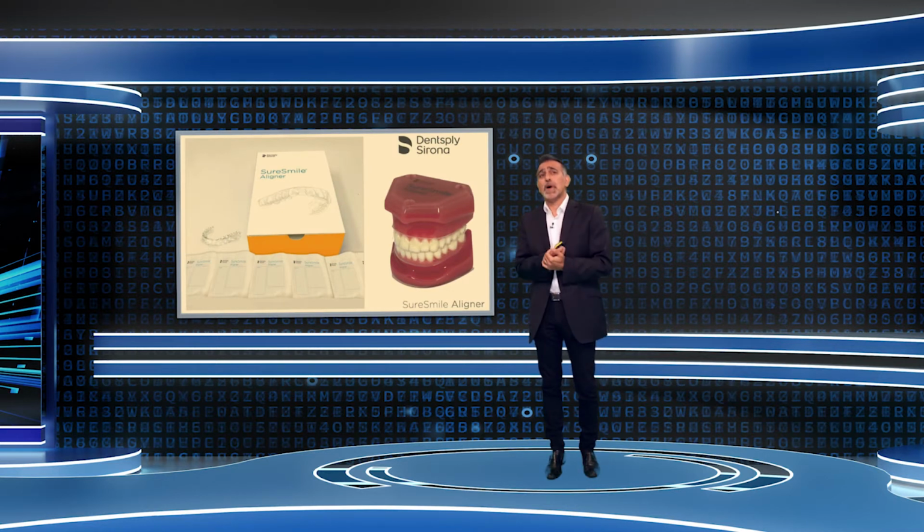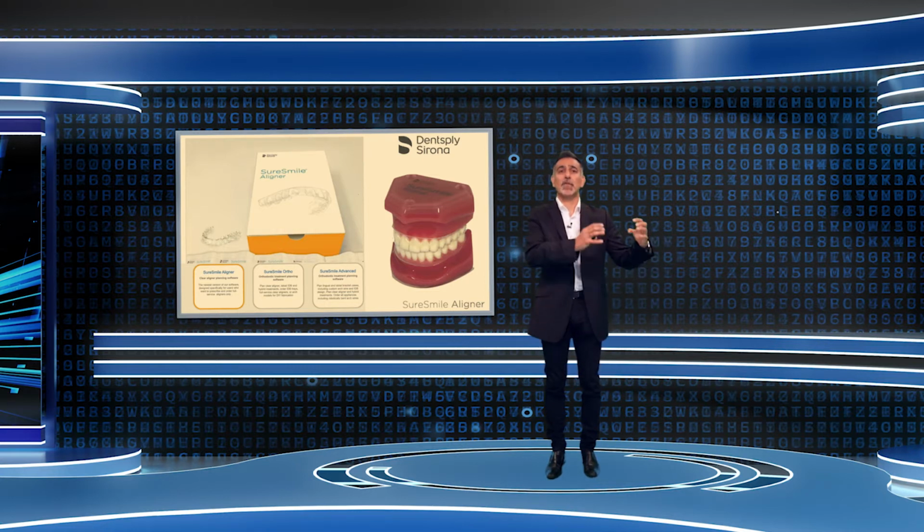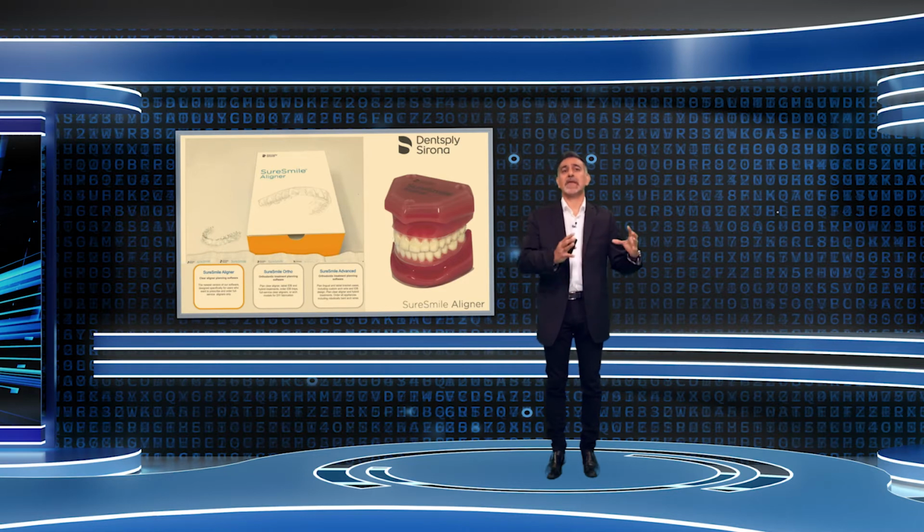So this is where SureSmile comes in, and I've been using SureSmile now for some time, done many cases. There's three main sections with SureSmile. You have SureSmile Aligner, that's what I use, which is fundamentally a clear aligner system where you will send your scans off with some instructions, and it's a full workup done by technicians who you'll discuss with. You'll see your digital setup, you'll agree with it, and then off you'll get your aligners come to you.